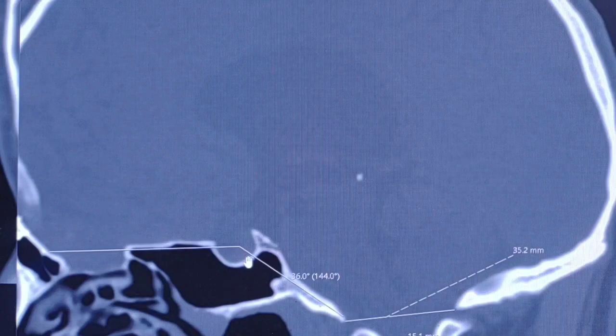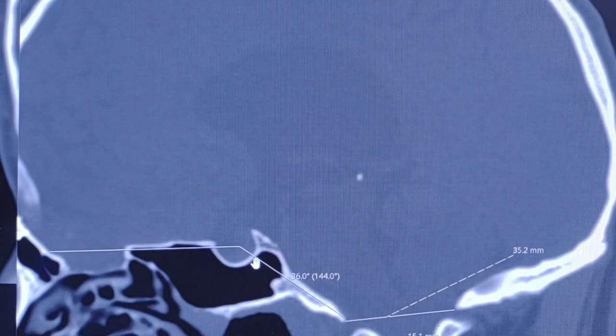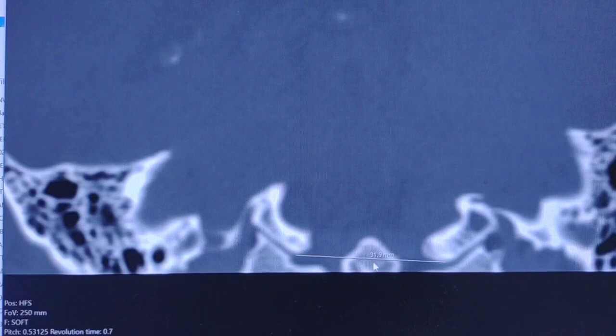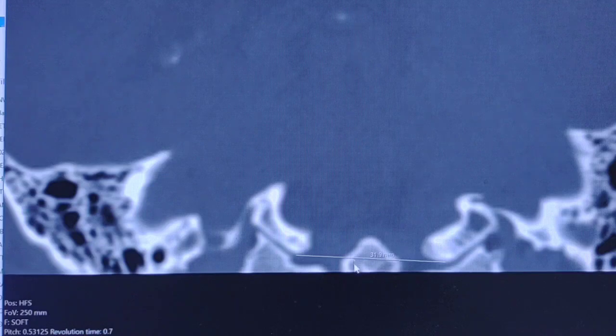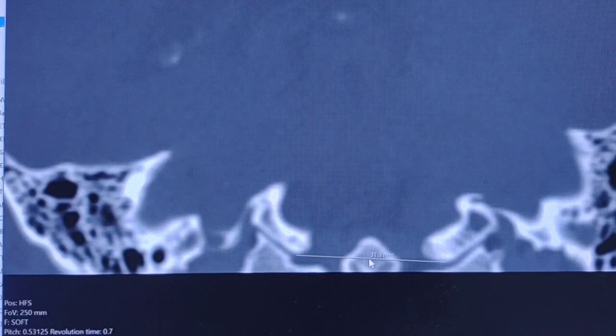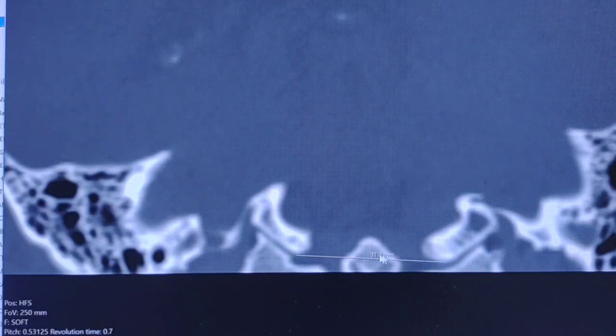But in this case, the patient also has basilar invagination, also called basilar impression. This is a congenital or acquired craniocervical junction abnormality where the tip of the odontoid process of the C2 vertebra projects above the foramen magnum, like in this case.